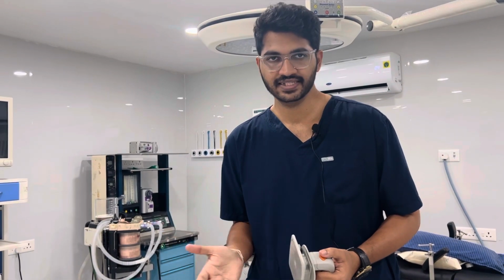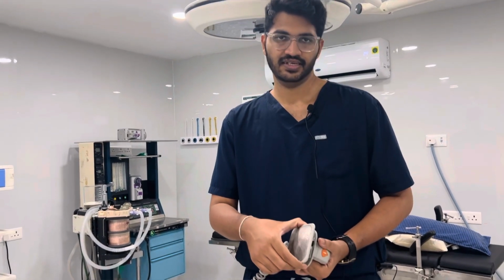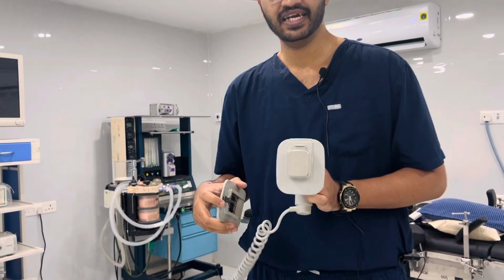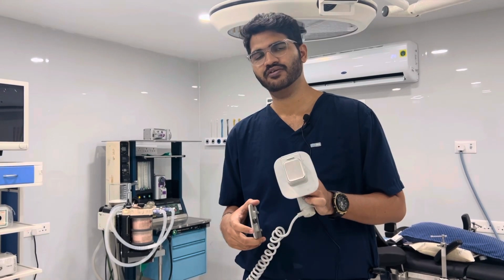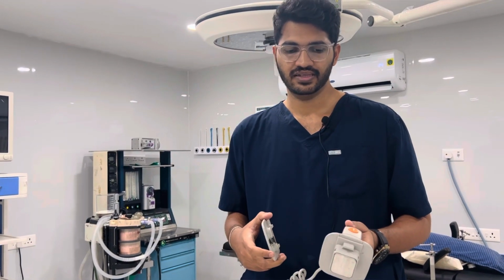What about the joules for pediatrics? As per PALS, the amount of energy we have to deliver is 4 joules per kg. This is the adult paddle, and there is a clip; if you remove the clip, what you see is the pediatric paddle. This is used for the pediatric setup, and the formula is 4 joules per kg. That is something I had to mention.